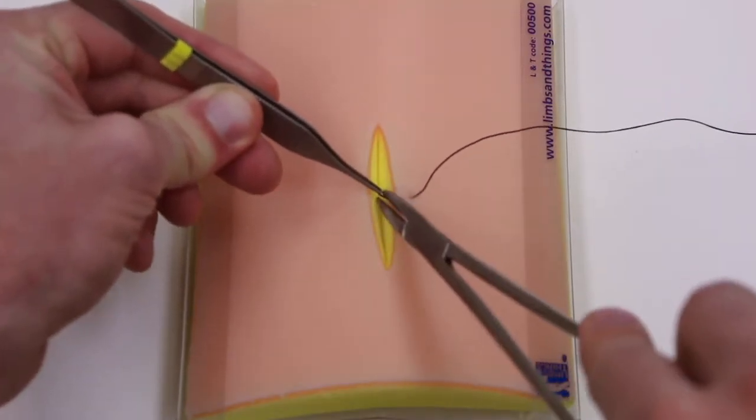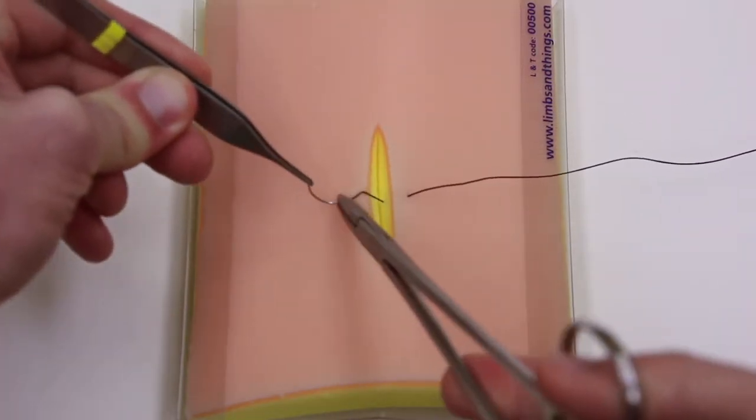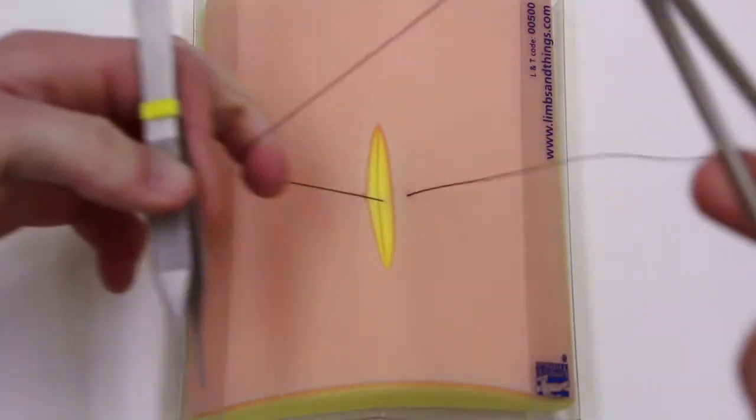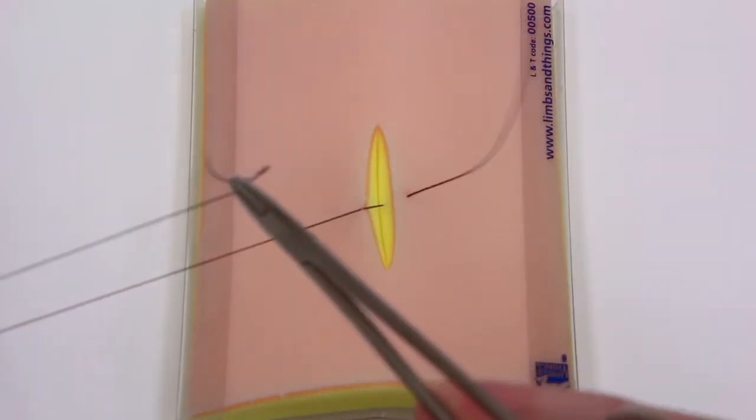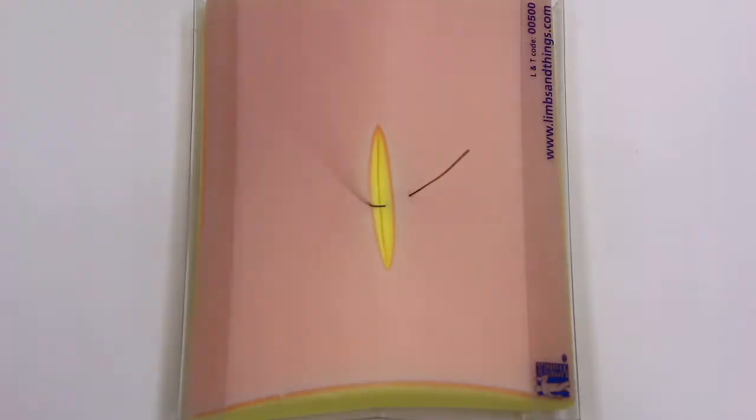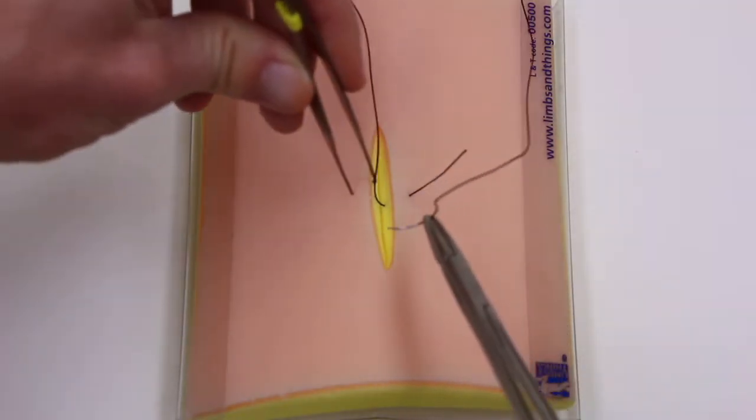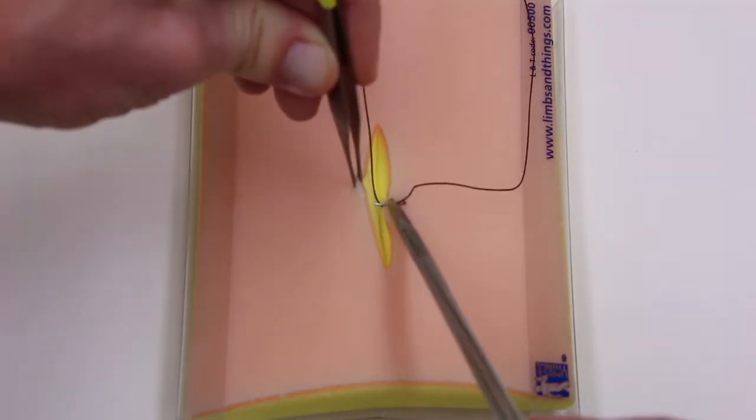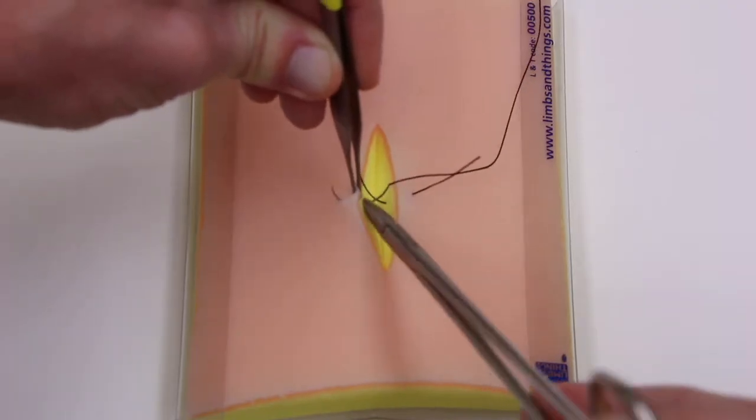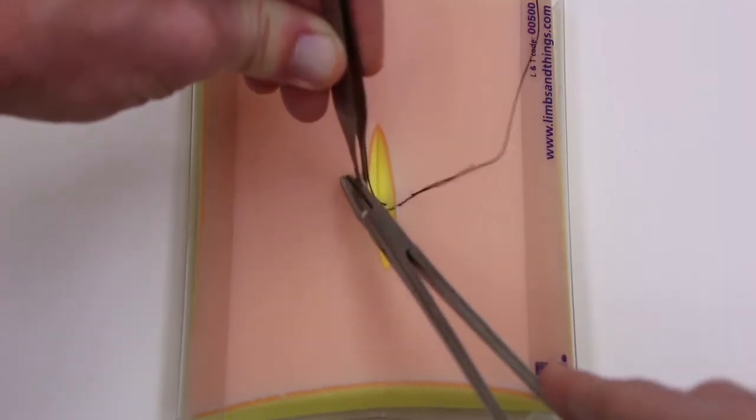So reloading in the field there can be just a little quicker. Pulling through so you just have a short end, grabbing the skin on the other end. Let's you get a good look at it, coming out about equal distance from the skin compared to the other side.